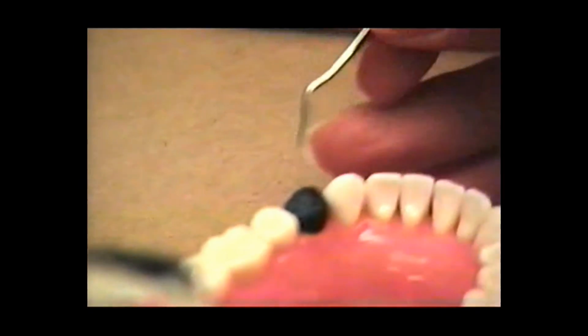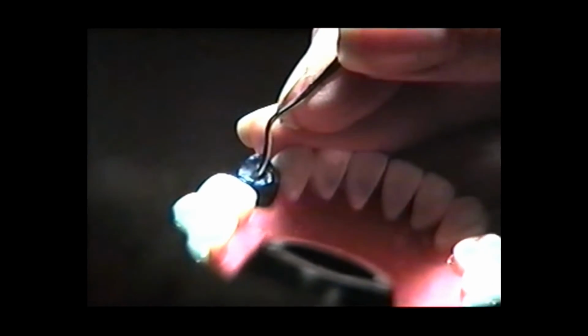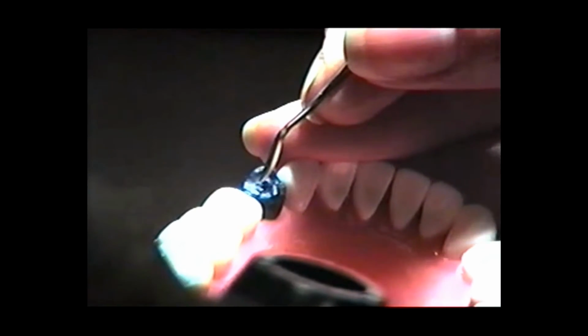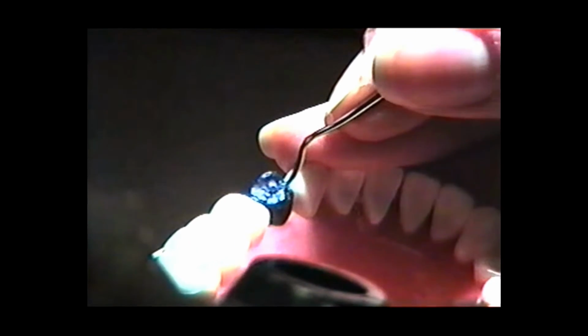Okay, I don't know how much of this you'll be able to see, but what I do is trace out where I want my groove pattern to be. I'm looking at the contralateral tooth, and I'm just doing a line so that I have a guide of where I need to go for my groove pattern.